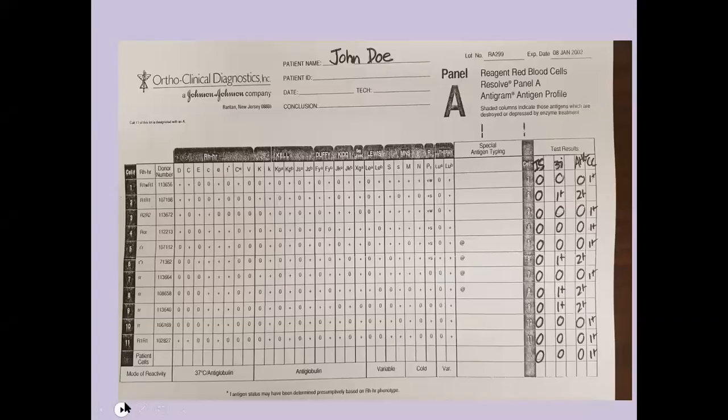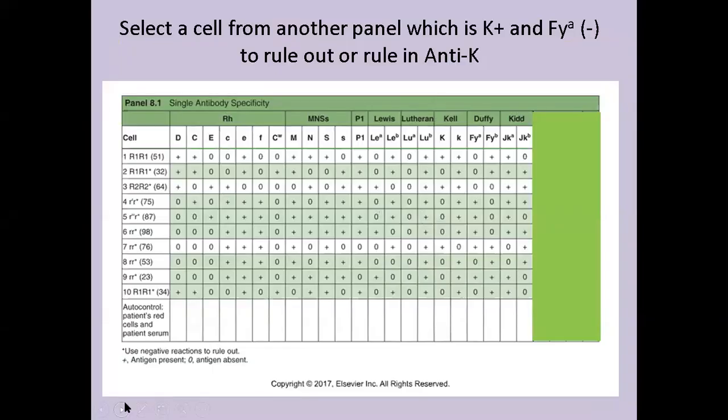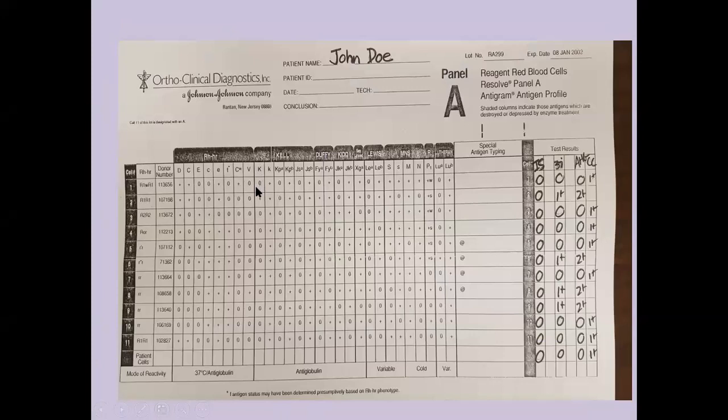Okay, so let's move on. This example was here because I think when I used this panel last year, I applied dosage to everything, and so we did not eliminate the big K because it was heterozygous. So let's just do an example. Let's say we did not eliminate the big K from here, okay? And we see that some of the big K reactions kind of match. Well, maybe one of them does.